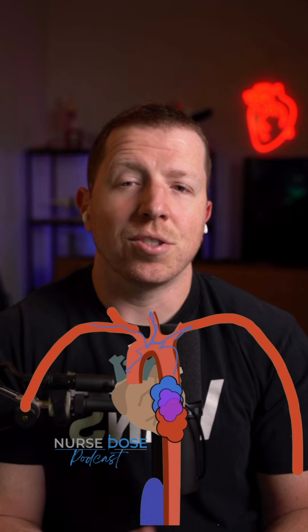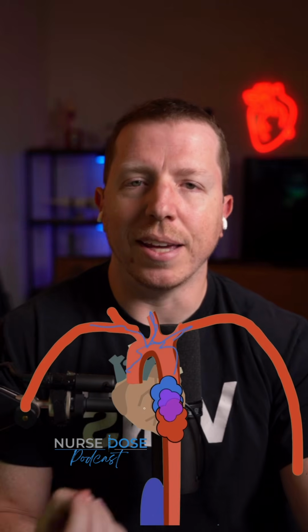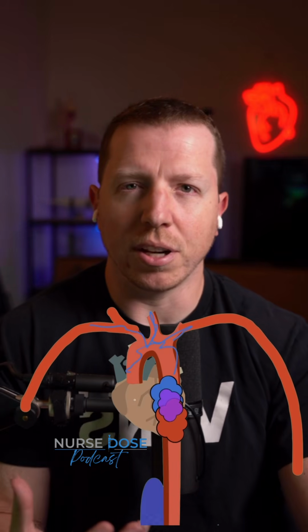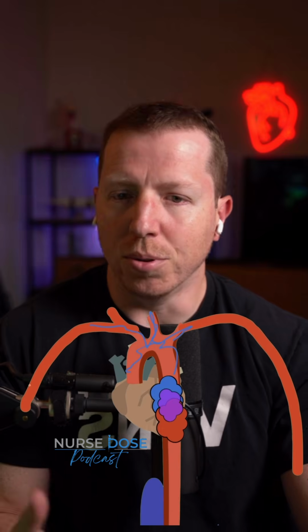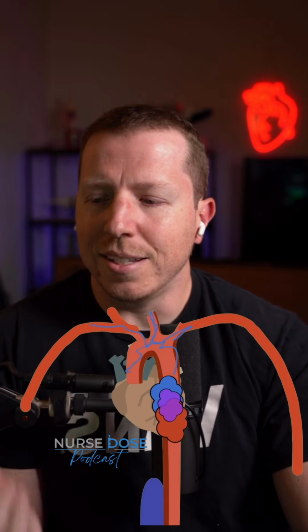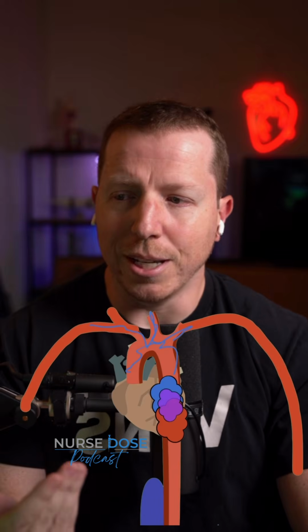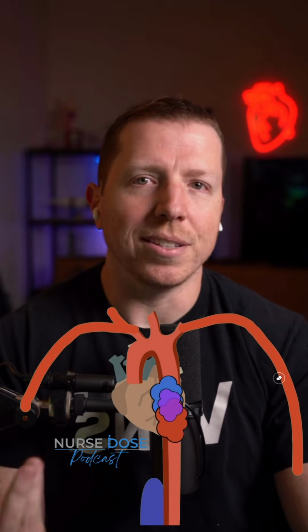Now, because of this illustration, you might be able to tell why this is such a big deal, where the mixing cloud actually is. So if it is down the aorta, you could see that if the heart is pumping out this deoxygenated blood or this poorly oxygenated blood, and it goes to the limbs or even to the brain, that we could have some pretty major consequences. So the idea behind this is that we maximize where the mixing cloud is supposed to be. And so there's a couple of things that can influence where our mixing cloud actually is.